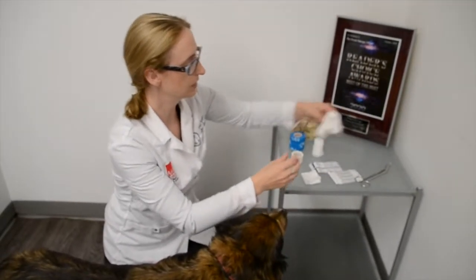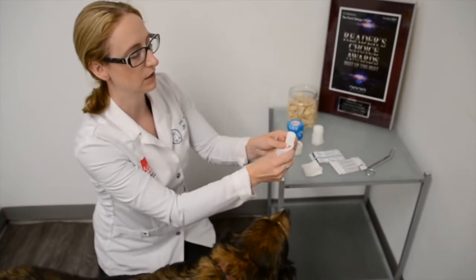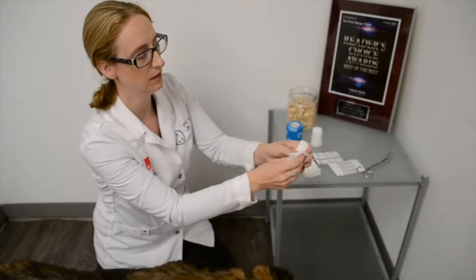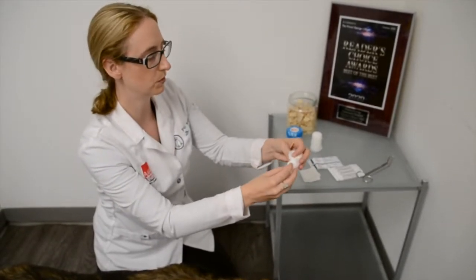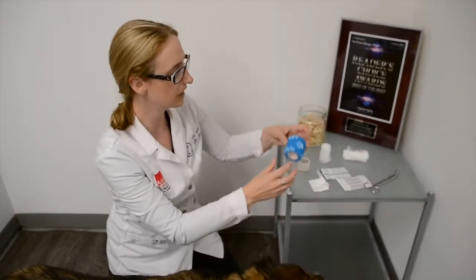Okay, this here is something called cast padding. This is, again, an extra absorbency layer, or if you need a little extra structure. It's just cotton. You can actually even tear it if you need to. We're not going to use that today because we're just going to go for a very light bandage, but that does exist for bandaging.